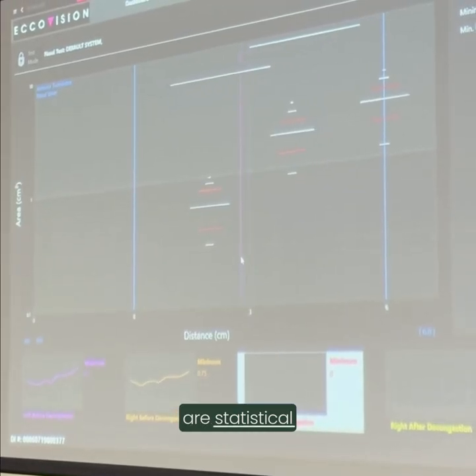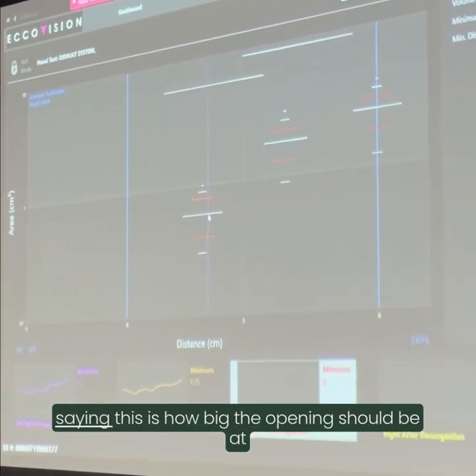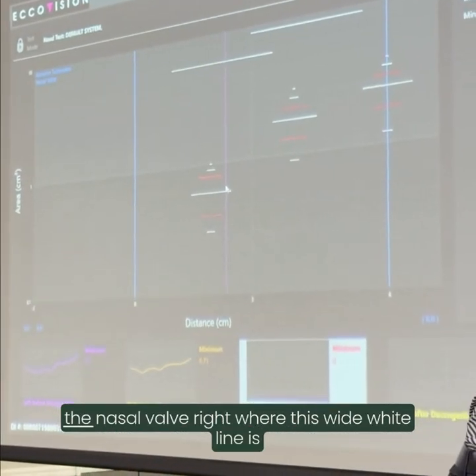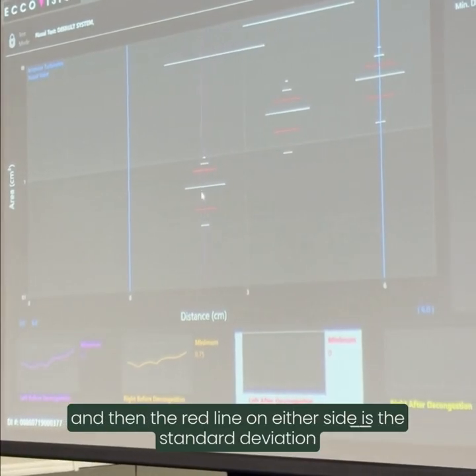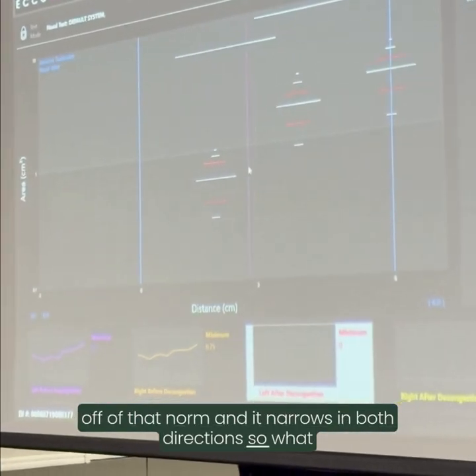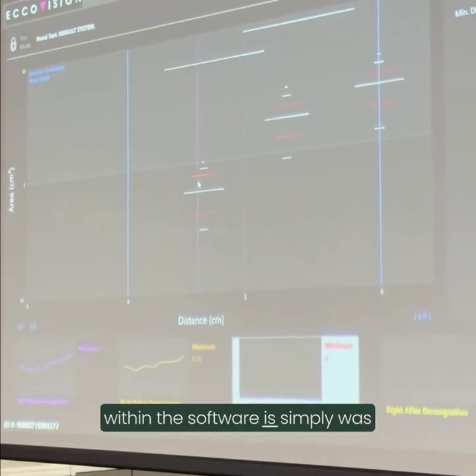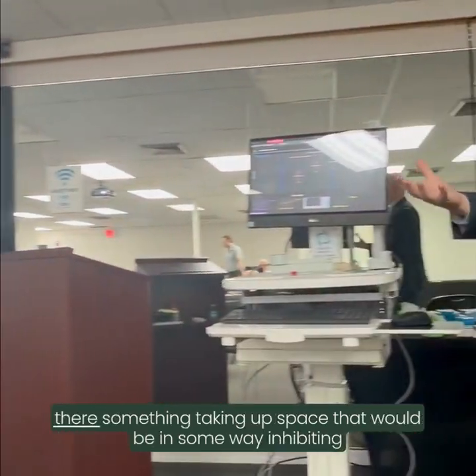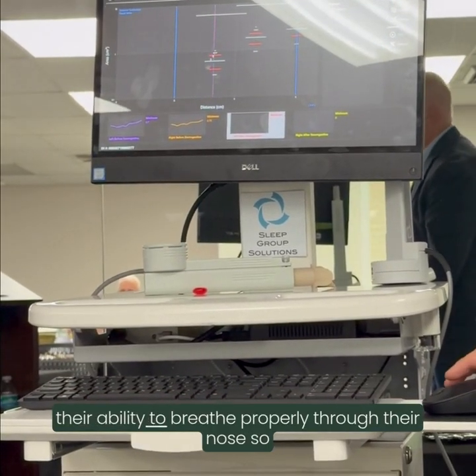Those are statistical norms. Essentially, this first marker is saying this is how big the opening should be at the nasal valve, where this wide white line is. And then the red line on either side is the standard deviation off of that norm, and it narrows in both directions. So what we're looking for, and what our notes within the software would say, is simply: was it within normal limits or not? Was there obstruction? Was there something taking up space that would inhibit their ability to breathe properly through their nose?